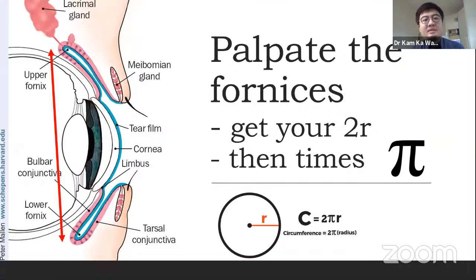When we go to the bedside, we apply the amniotic membrane. We usually will need to check the size, the diameter of the symblepharon ring. So we palpate for the fornixes and then do some math, and then we will calculate the circumference required for the ring. We usually make several rings, and then we fit it before we use it on the patient.